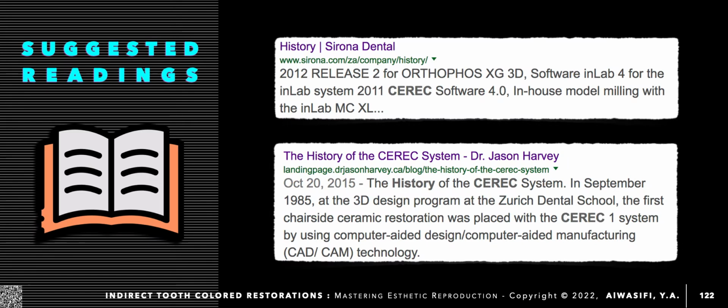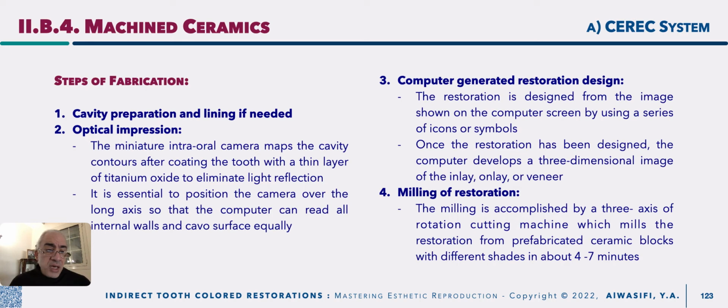Those were two articles I recommend to you if you would like to read much more about the history of the CEREC system. Actually, I thought they were reviewed and updated and you could get much more information than what I had discussed. Let us go for the clinical part.